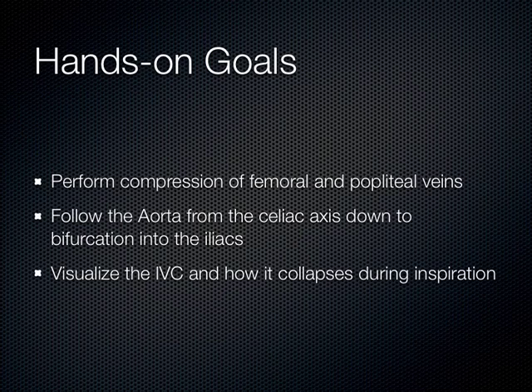That's about it. If you want to move on and ask other questions, you have time left in your group, by all means, scan whatever you want today. Use it as a free scanning session to tighten up wherever else you have questions, heart, whatever it is you want to do. But really today, it's the DVT, aorta, and IVC.